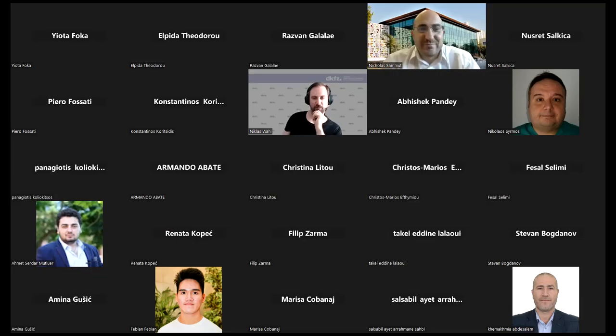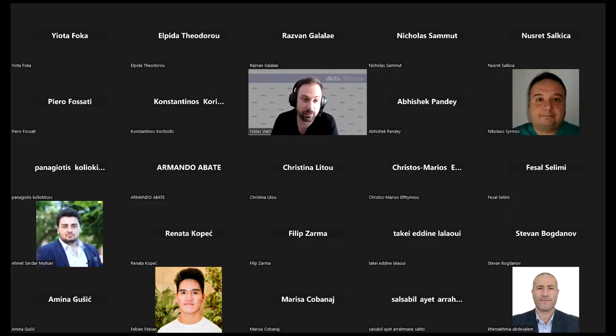Yes, welcome everybody. Thanks a lot for inviting me to the school again. And also again, the opportunity to do a little bit of, I have to admit, rudimentary treatment planning tomorrow. And we will use an open source software that we develop at DKFZ for that. It does, of course, not have all the features that a clinical particle therapy treatment planning system has, but this tool will allow us to explore some of the specifics that you have to deal with during particle therapy.